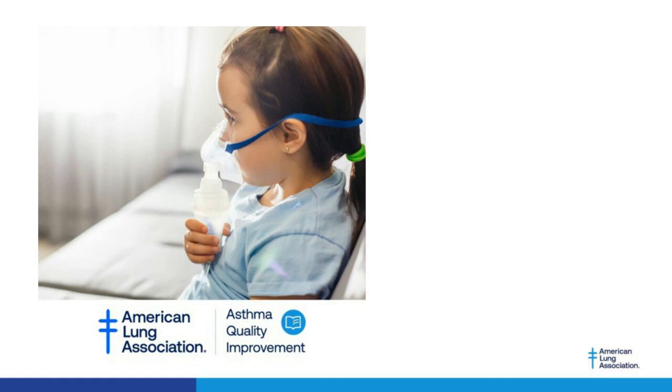I was told that in my pediatric lab, all they needed to do was change some things, and when it was retested for air balancing, the air exchanges went from 6 per hour up to 12, which decreased the wait time considerably. People have suggested doing these spirometry tests outside. That sounds fun in a nice climate, especially today. It's beautiful outside here in Minnesota, but it's probably not going to work very well when we have 10 below weather. Very nice question.